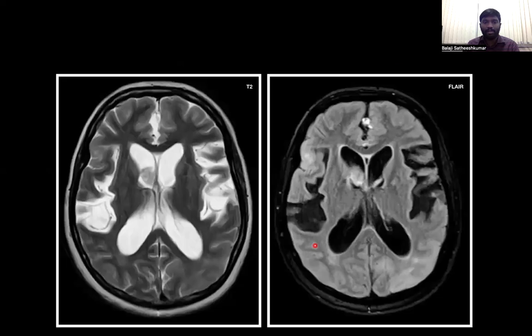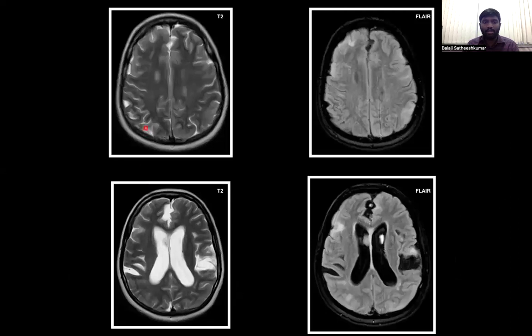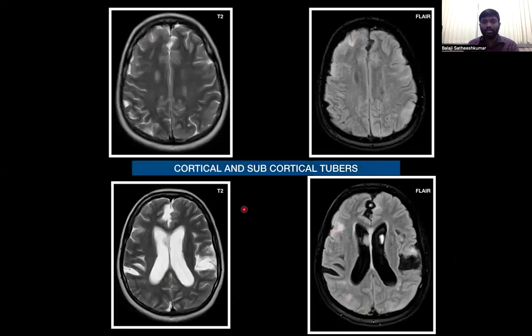Moving on to the next case, here we see a T2 hypointense and FLAIR hyperintense lesion involving the frontal horn of the right lateral ventricle. In the case of tuberous sclerosis, this is diagnostic of a subependymal giant cell astrocytoma. From the same patient, we also see discrete and confluent T2 FLAIR hyperintensities in bilateral frontal and parieto-occipital regions, suggestive of cortical and subcortical tubers in tuberous sclerosis.